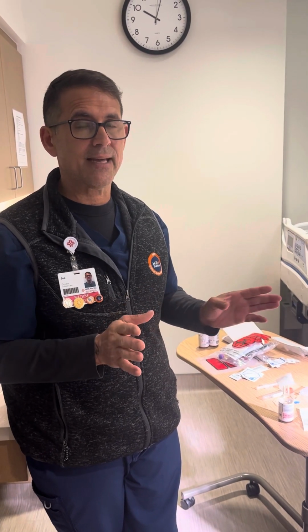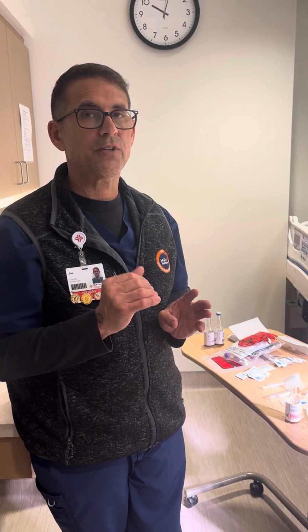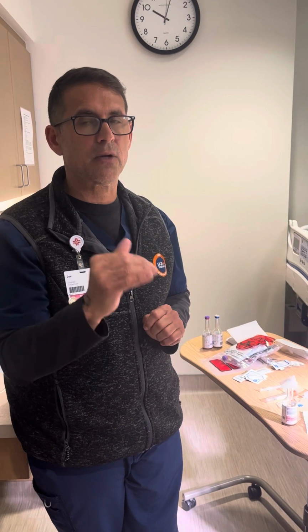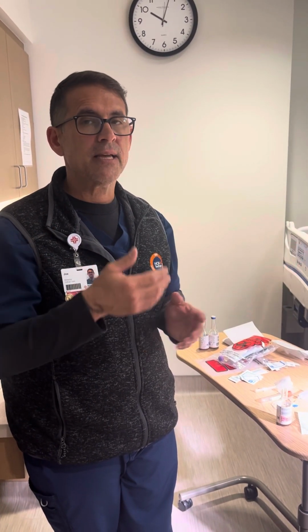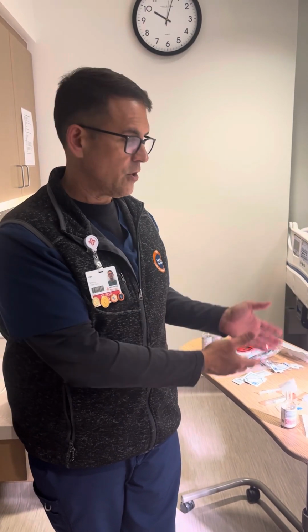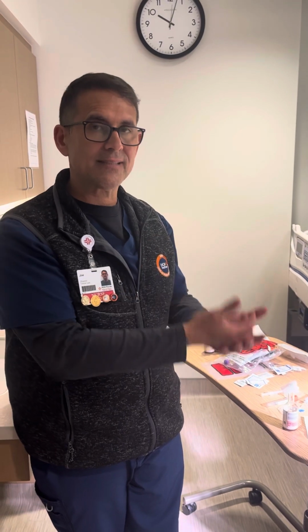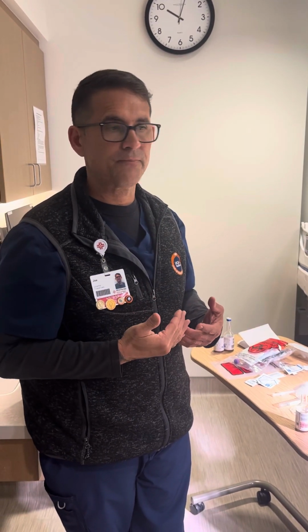And if they do order 2 sets on a kid, they have to be done in 2 separate sites, and they have to be done 15 minutes apart. Mobilab will not allow you to; it will look like you're doing the same blood culture twice if you do it within the same span. So if you're doing 2 blood cultures and you go to print your Mobilab labels, you have to print the first one when you collect your first culture, and then print the second one at a different time when you collect your second culture. You can't print all your labels first because it'll look like you collected all 4 at the same time.